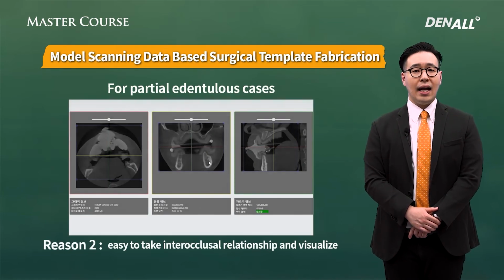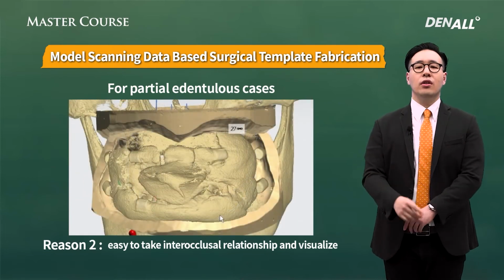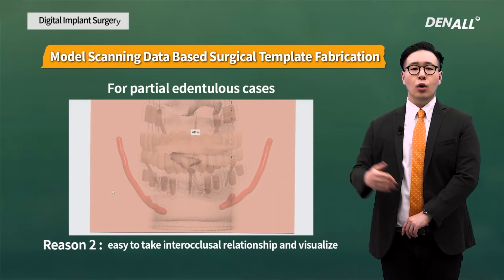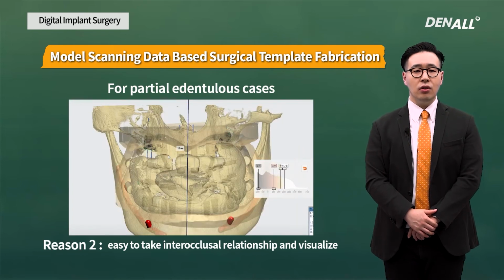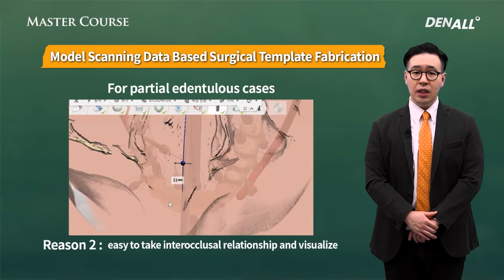Second reason is interjaw relation. That means the vertical dimension from CR range can be easily acquired. In the video, by referencing the patient's anatomic structures, for example, the nasal septum or nasal spine, on the stable interjaw relation, the midline and temporary prosthesis are positioned.